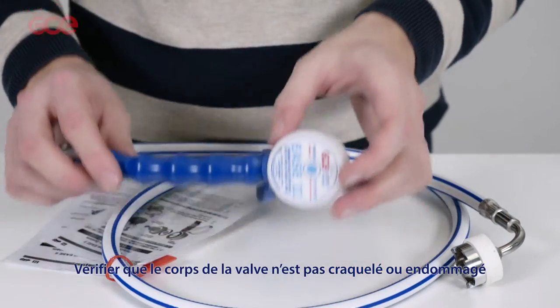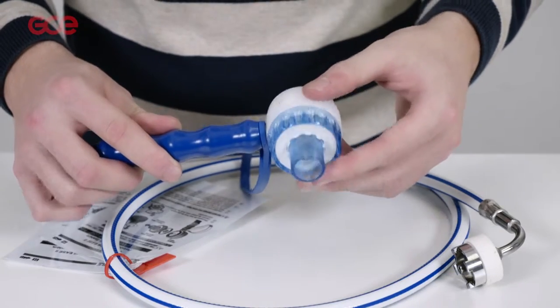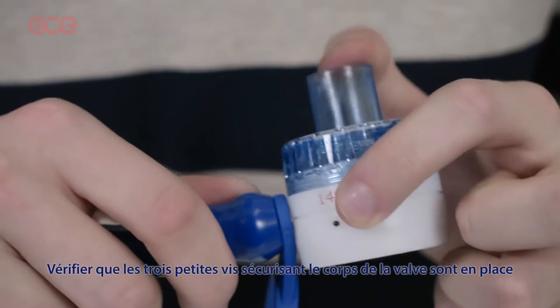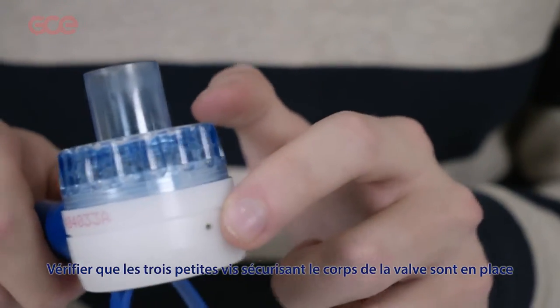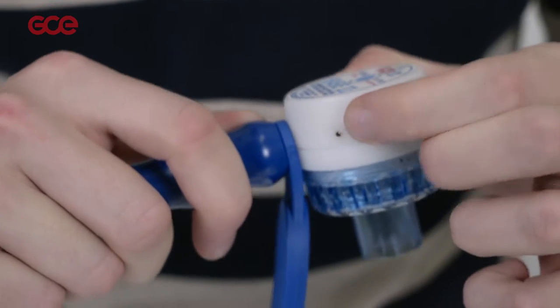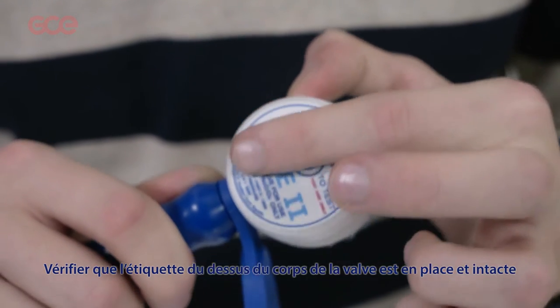Check the demand valve body and rear cap are not cracked or damaged. Check that the three small grub screws securing the demand valve rear cap to the main body are in place. Check the label on the rear cap is in place and in good condition.